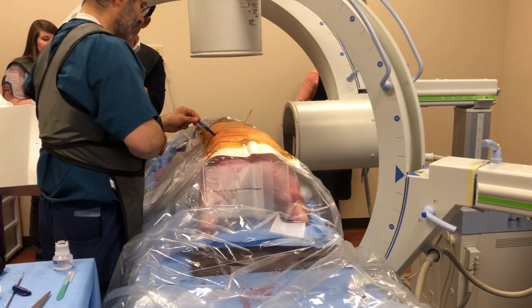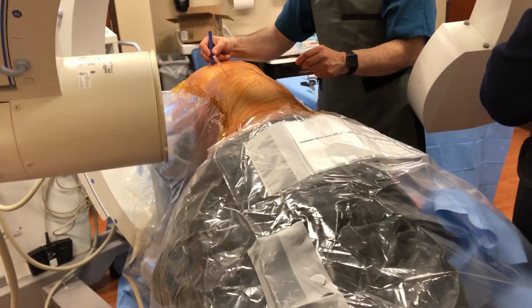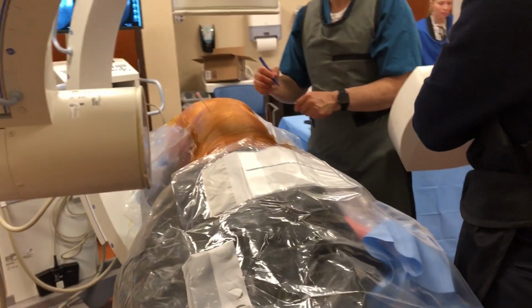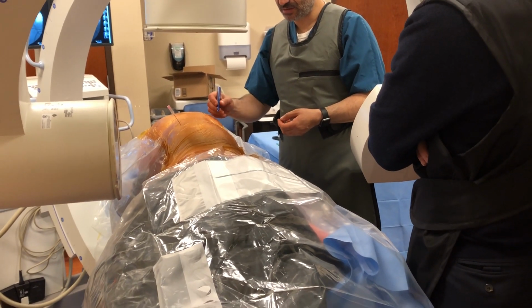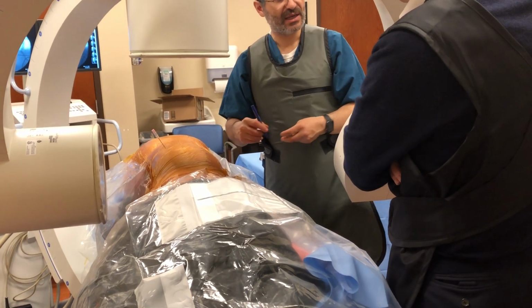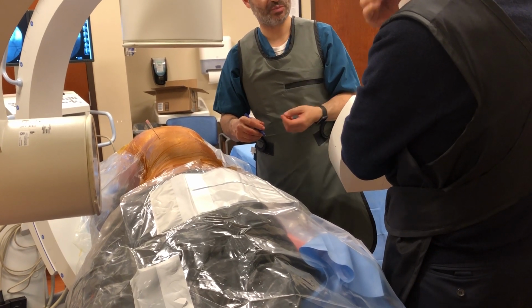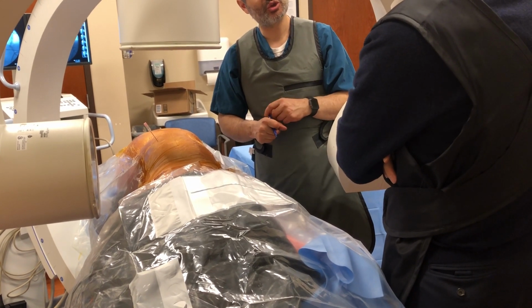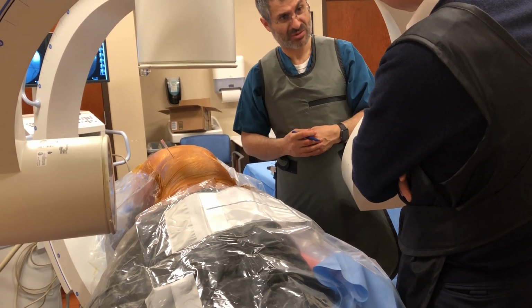Literally, then, not only the iliac crest, but as well the ala is here. Ala of the sacrum, you know? There is also a big transverse process of L5. You went anterior to that. You go truly direct lateral. In the last 3.5 years, only 3 times I had to interrupt the L5S1 and go open. All 3 of them were grade 2 spondylolisthesis. So it's a possible approach. We do it every day.